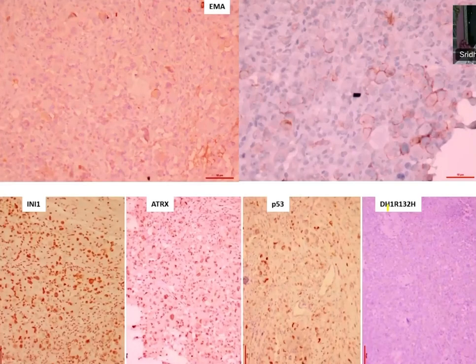BRAF is there, but at this point, because it is intraparenchymal, right within the brain parenchyma, you are thinking of an epithelioid, high-grade glial tumor of epithelioid morphology. So what are the differentials? Glioblastoma, epithelioid glioblastoma, or sometimes a high-grade pleomorphic xanthoastrocytoma, which can have epithelioid morphology. But usually a high-grade pleomorphic xanthoastrocytoma can have low-grade areas, and uniformly it will not have the same morphology everywhere. They will have some heterogeneity.